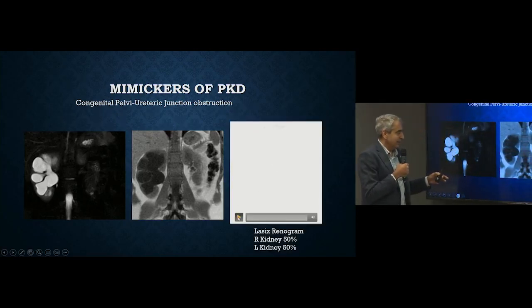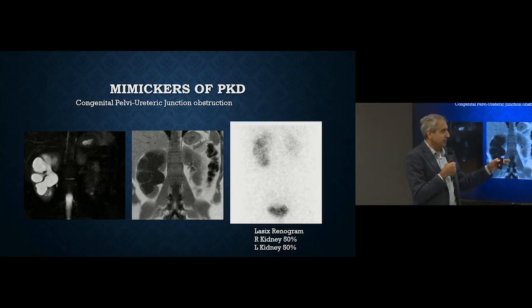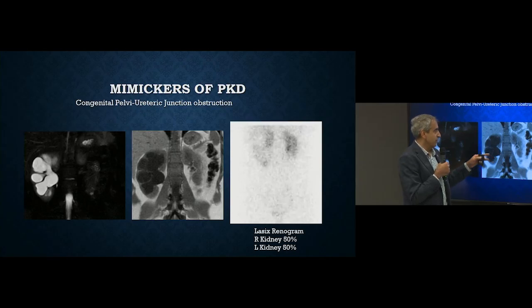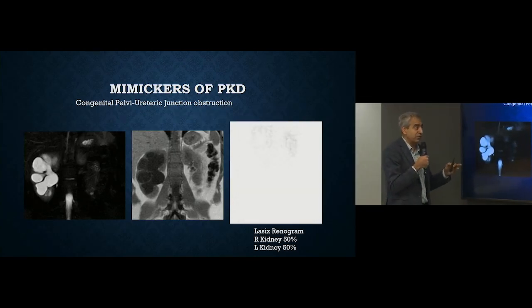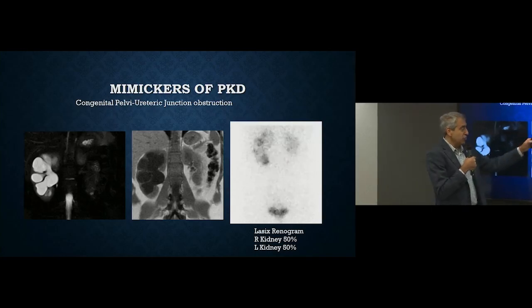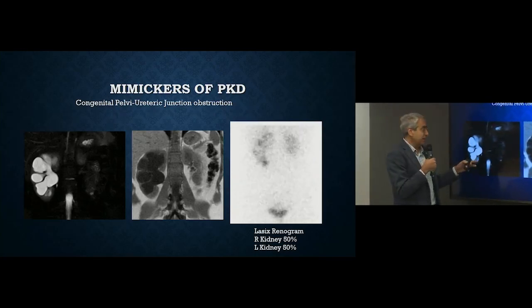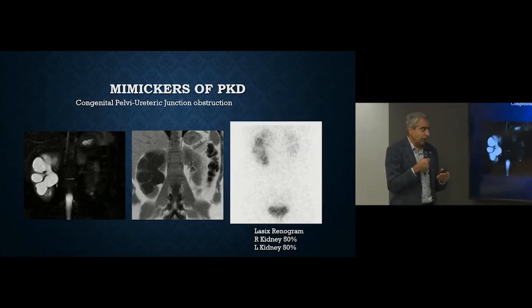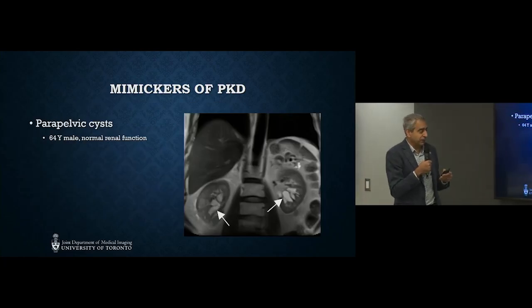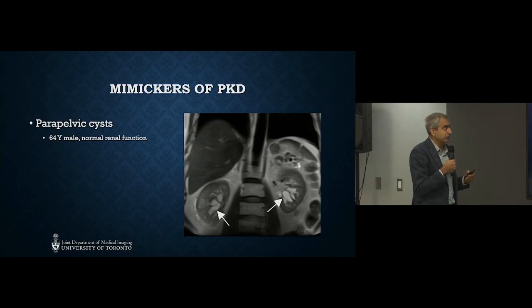Yeah, if it works. So here in these patients, we can actually determine whether or not this is functionally causing diminished function in the kidney or diminished excretion from the kidney. And in fact, a lot of times it doesn't. These are dilated collecting systems, but there is symmetry in terms of the function of the kidney. So just a dilated collecting system without actually affecting the excretory function of the kidney.